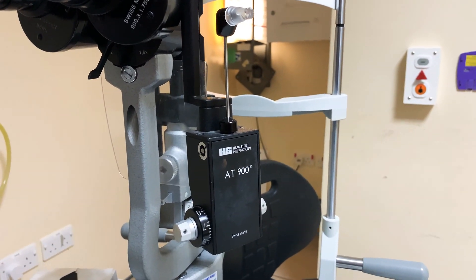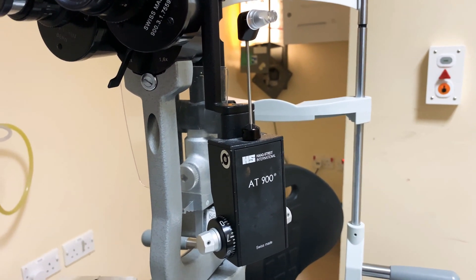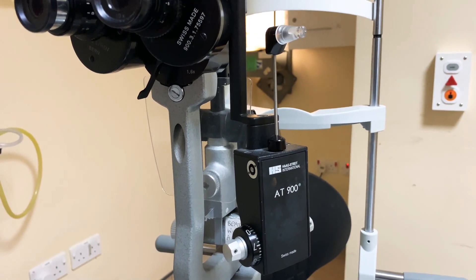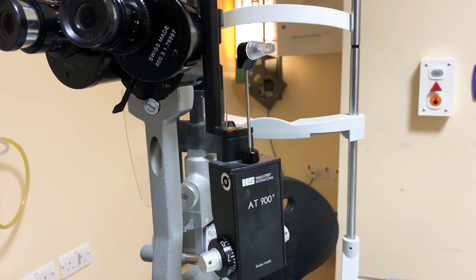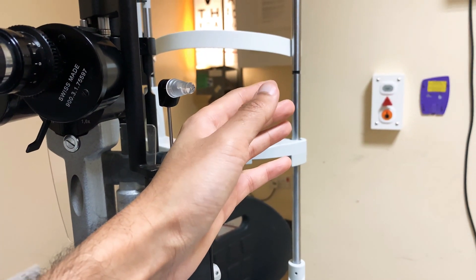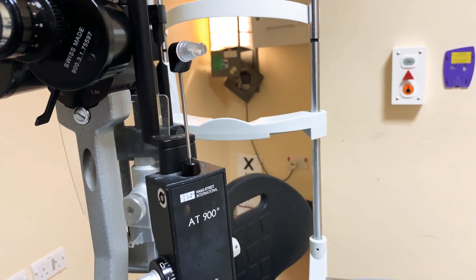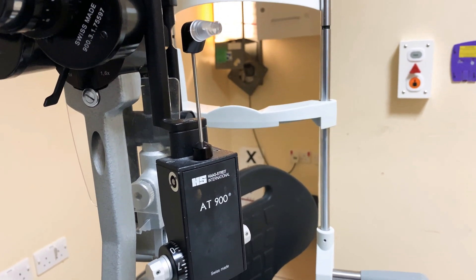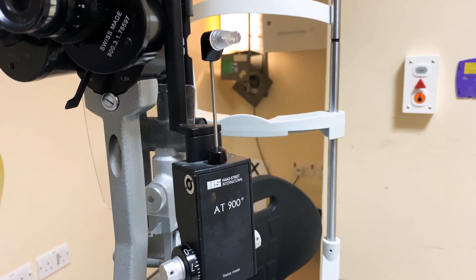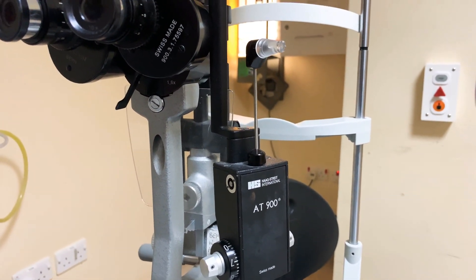This is the Goldman Applanation Tonometer, used for checking eye pressure. I probably wouldn't expect an emergency department team to use it as it's quite difficult. If you're worried about glaucoma or raised pressure, the best thing you can do is gently, with the patient's eye closed, feel how hard the eye is with your thumb and compare both eyes. If the eye is rock hard and the patient has a painful, red, swollen eye with blurred vision, they may have angle-closure glaucoma.